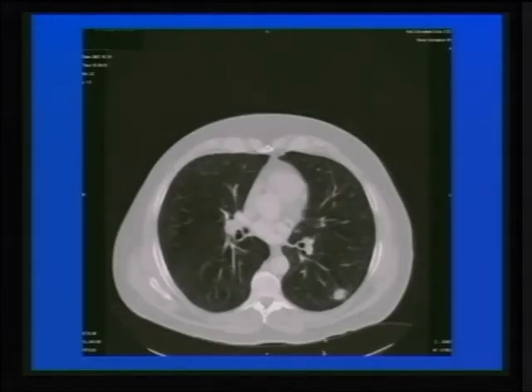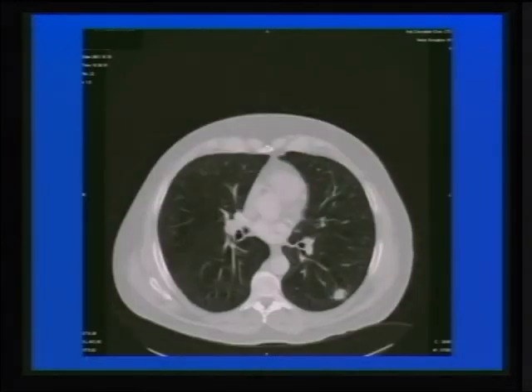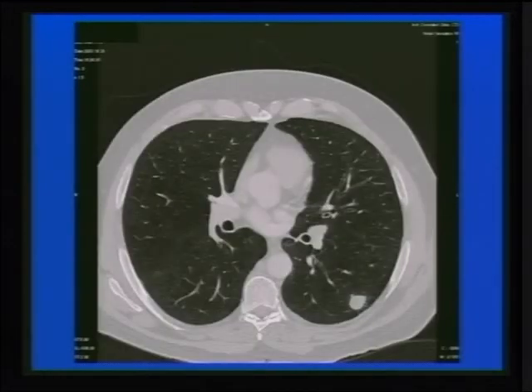How about this one here? You do a high resolution scan. You also note the fact that the patient has lymph nodes. Spiculated margins on high resolution, a little bit of emphysema. What is this, with adenopathy? Cancer, no cancer?